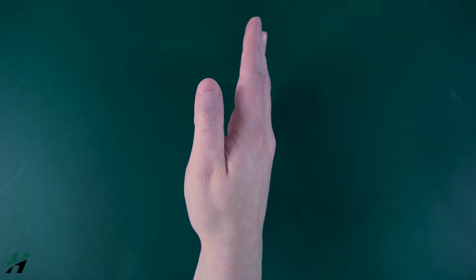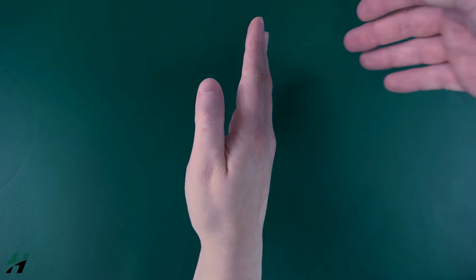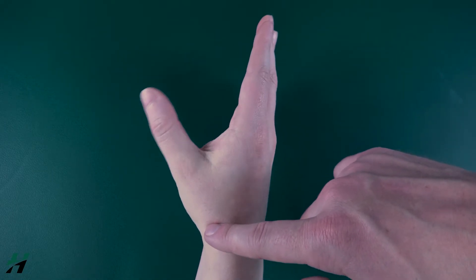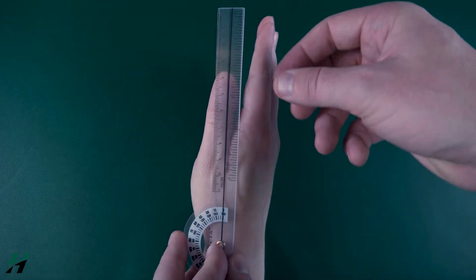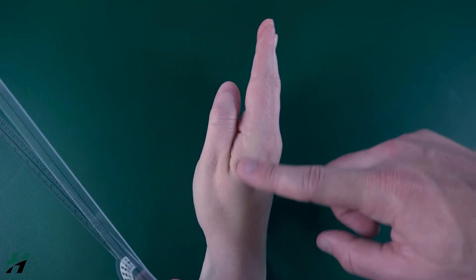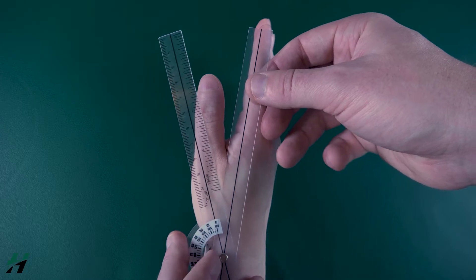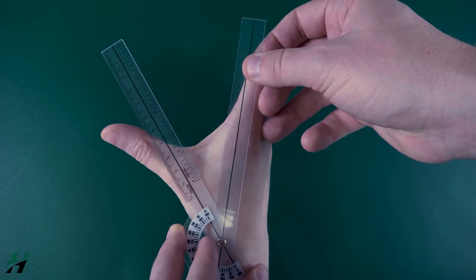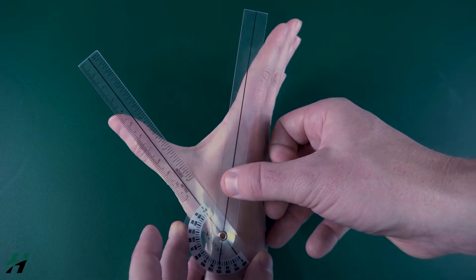Measuring thumb palmar abduction, also known as CMC abduction. Once again, find the true CMC joint near the anatomical snuff box — that's where we place our axis. The stationary arm goes on the lateral aspect of the second metacarpal, and the movement arm on the shaft of the first metacarpal. Rachel, extend your thumb out as far as you can. We're looking at 46 degrees of abduction.